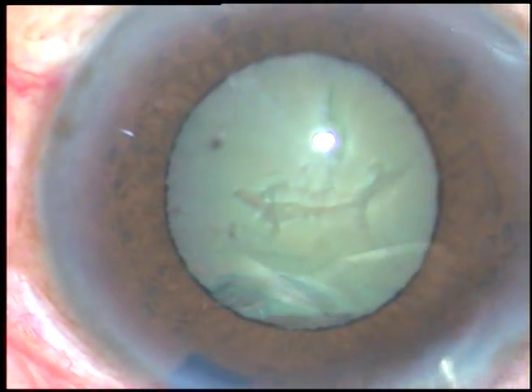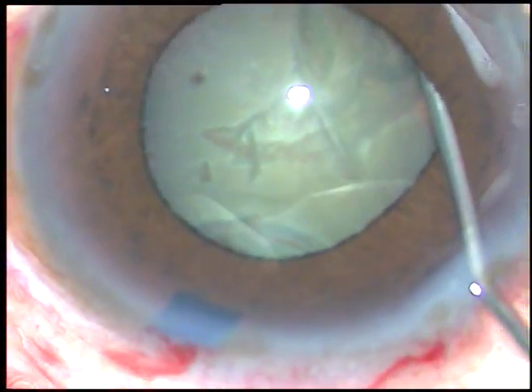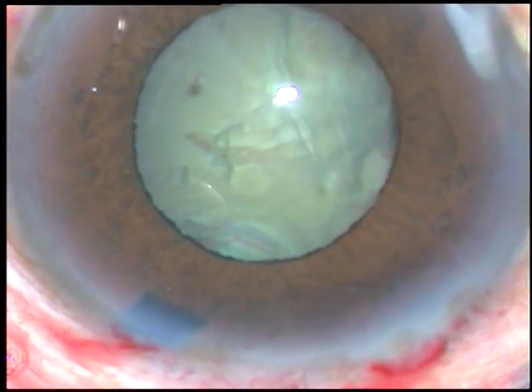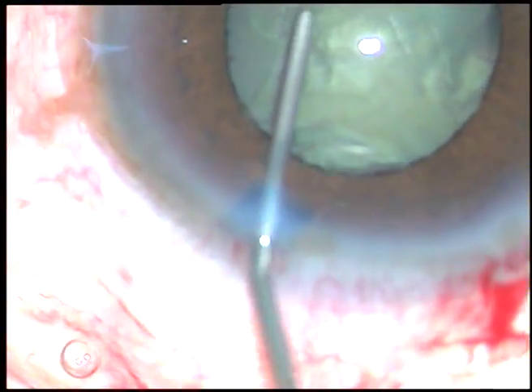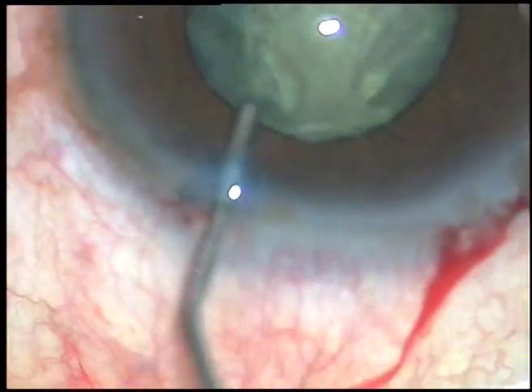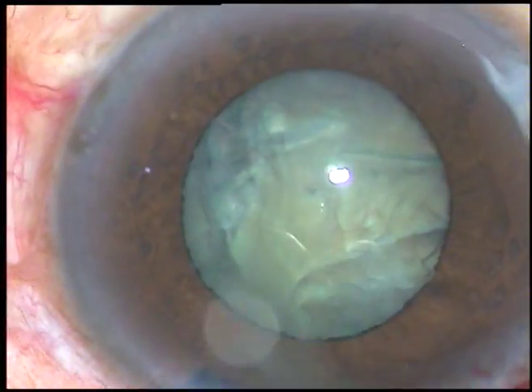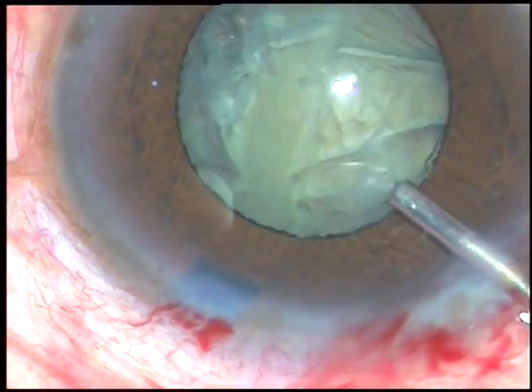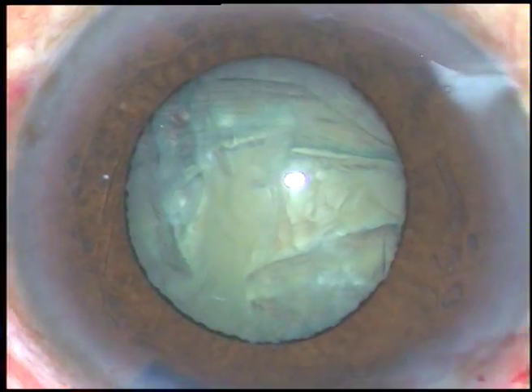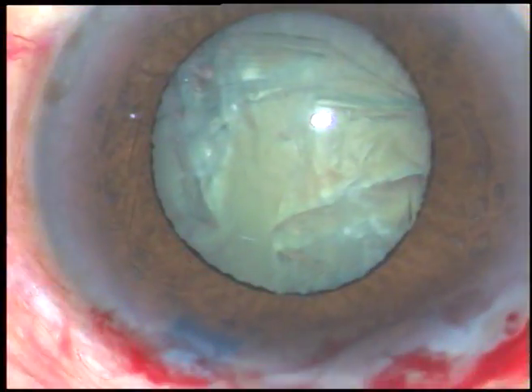Could not see the fluid wave. You just have to see that the nucleus is getting lifted off a bit. Then tap the nucleus and try to mobilize it. As the nucleus rotates freely, inject some viscoelastic substance and then introduce the tip — the phaco handpiece.